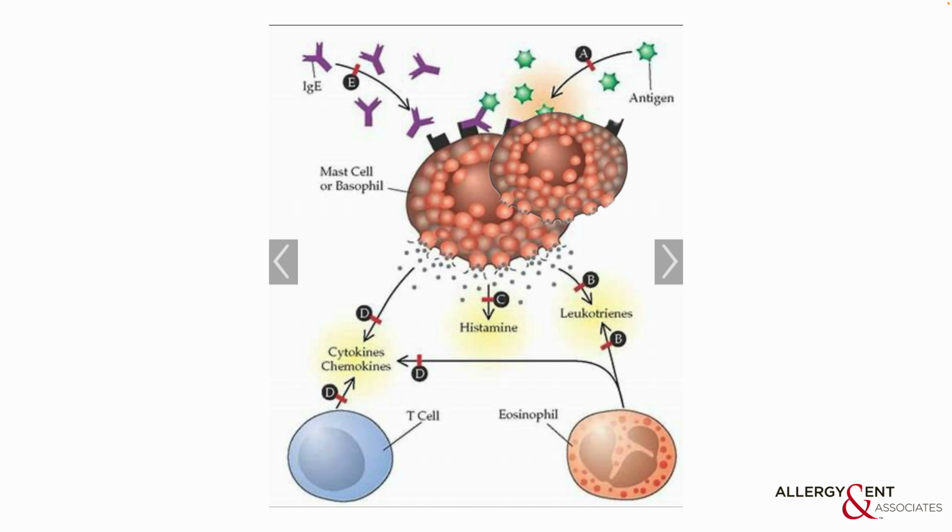Okay. So when we do the skin test, we place on the patient's skin what they are allergic to. There are millions of these mast cells underneath your skin. If the patient is allergic to a certain thing, the mast cell will be activated and release histamine chemical, and therefore we can read the test as positive when there's a histamine response.